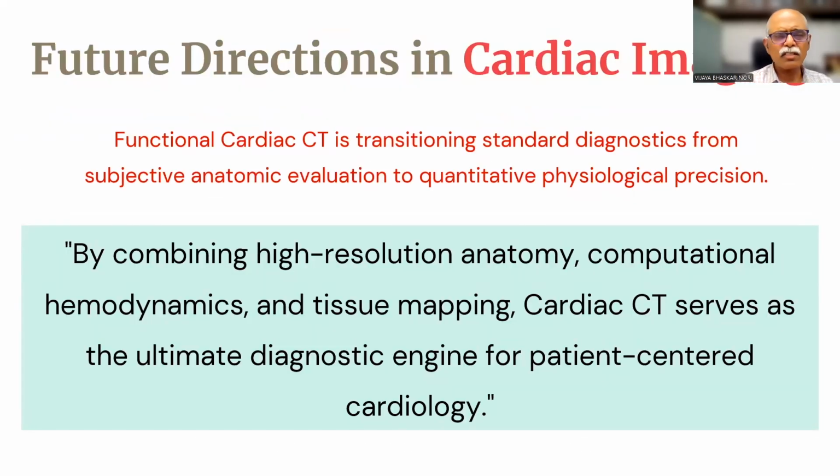So, future directions: functional cardiac CT is transitioning standard diagnostics from subjective anatomical evaluation to quantitative physiological precision. By combining high-resolution anatomy, computational hemodynamics like FFR, and tissue mapping, cardiac CT serves as an ultimate diagnostic engine for patient-centered cardiology.